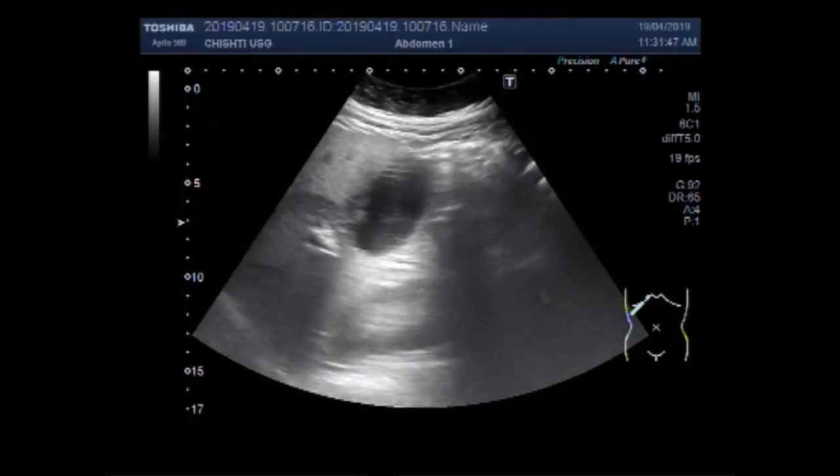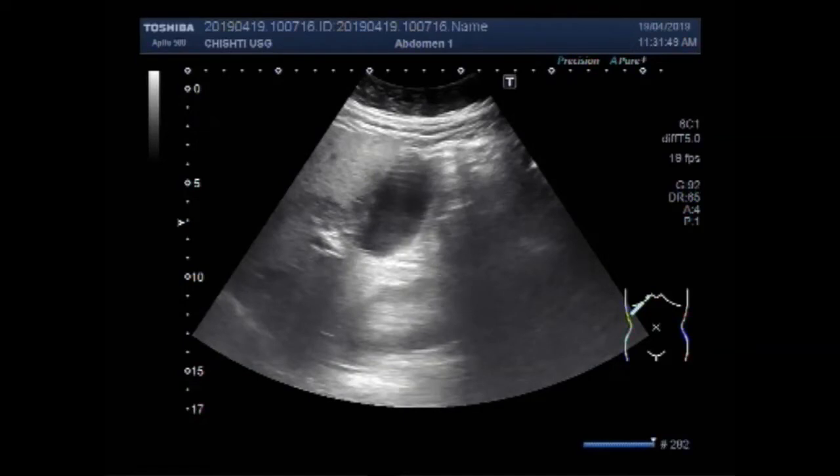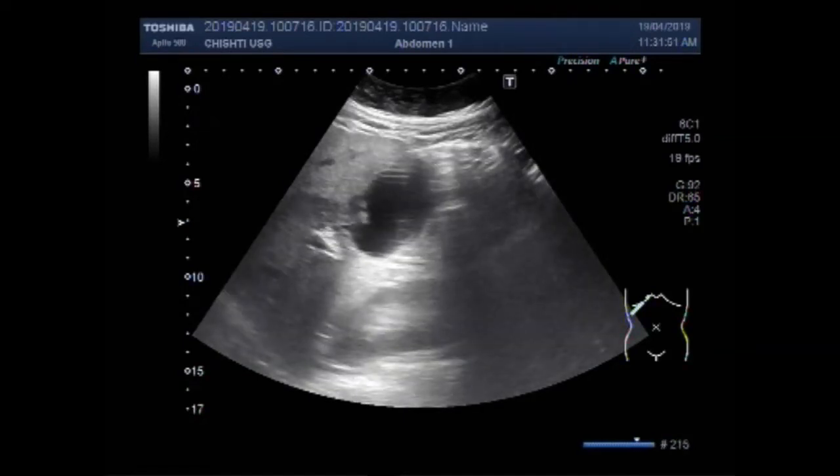Now you can see the multiple small polyps along the interior wall of the gallbladder. These are the multiple polyps in the gallbladder.